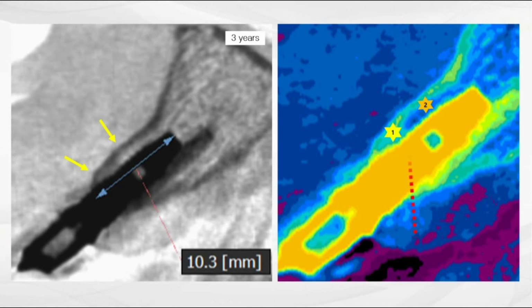Hence, the estimated prior skeletal envelope is on this point. However, the remodeling process is beyond this point to develop a new skeletal envelope like this. This labial bone area is newly regenerated alveolar bone with ridge augmentation accomplishment, and this shows the normal cortico-cancellous bone complex as its regeneration and preservation by this moldable AutoBT dentin powder.